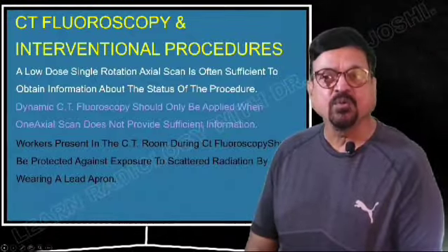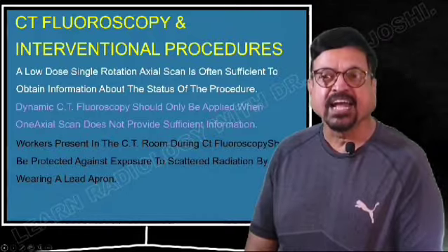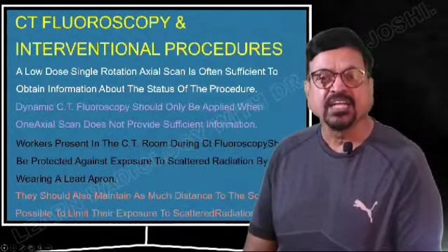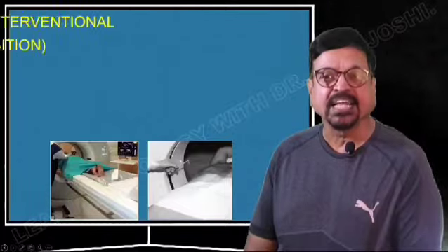The workers present in the CT room during this fluoroscopy should be protected. It is not the protection of radiologists, it is protection of the staff and also the patient. So, we should take proper precaution, we should wear radiation badges, we should wear a lead apron, and we should take all the precaution to get ourselves saved from the radiation.